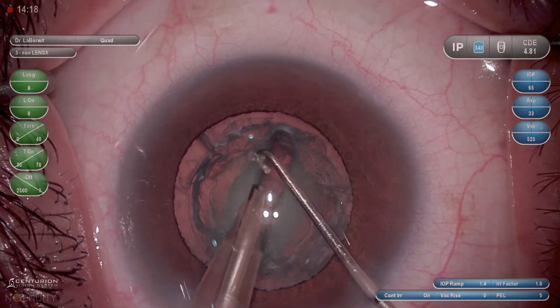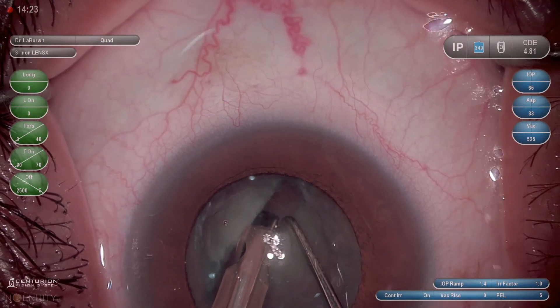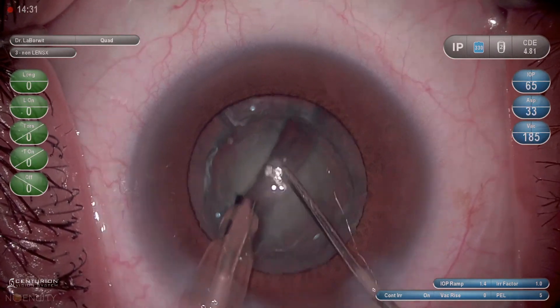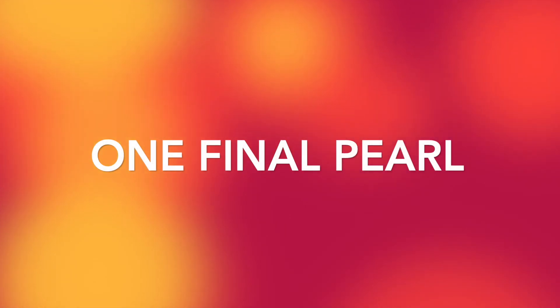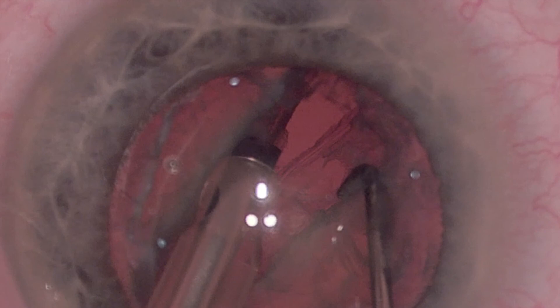As I enter the middle third, I'm flattening the tip, and as I enter the distal third, I'm sculpting upward. I then introduce a second instrument, cracking at the distal third. This allows for good vector forces by the instrument placement—going deep without much pressure on the bag—and then I unzip the initial crack as I march more proximal. One last pearl: take a moment and pause when you crack the plate to look at the thickness. This gives you feedback on how thick or thin you sculpted, and also alerts you that a thick plate may be more difficult to remove when pulling pieces out of the bag.